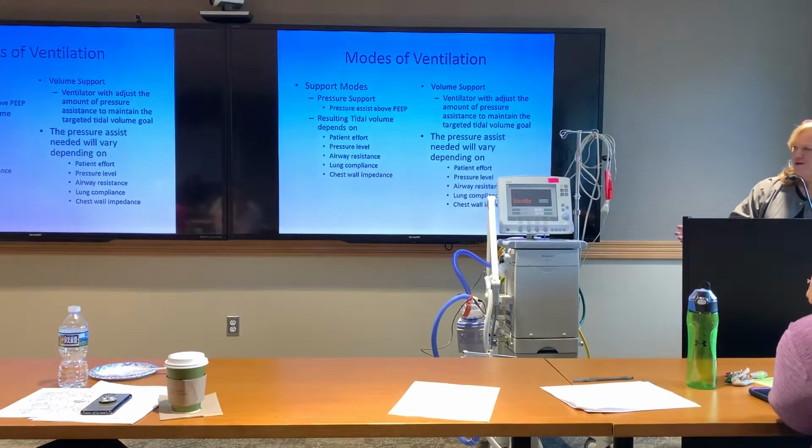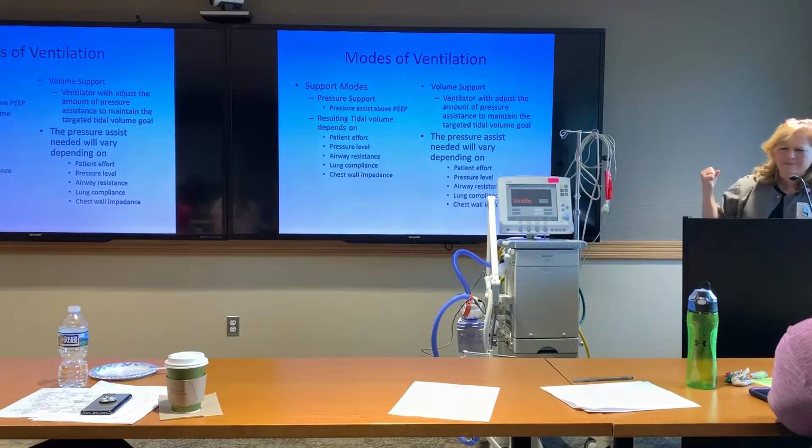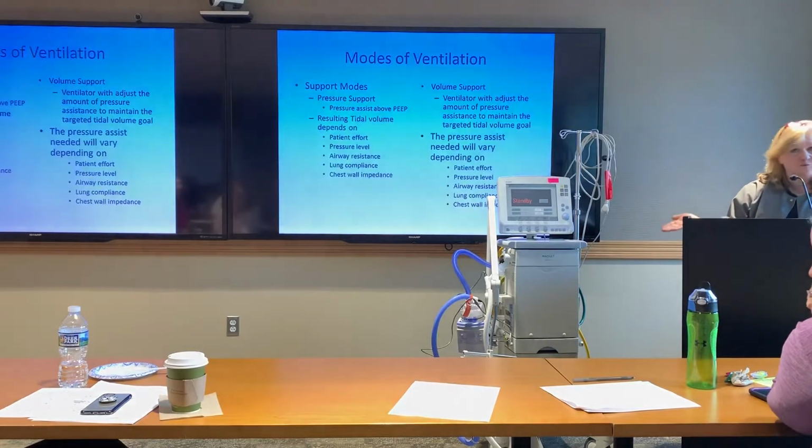Okay, it's actually not a great mode because it shows you have a pretty high work of breathing for the patient, because they're getting two different breath types. They don't really know what to expect, right? Sometimes they're getting this mechanical breath. Then in between, they can do what they want. But then that mechanical breath comes in, and they're like, what the heck was that? So it's just not real comfortable for them, right? Anyway, that's why we use pressure support.